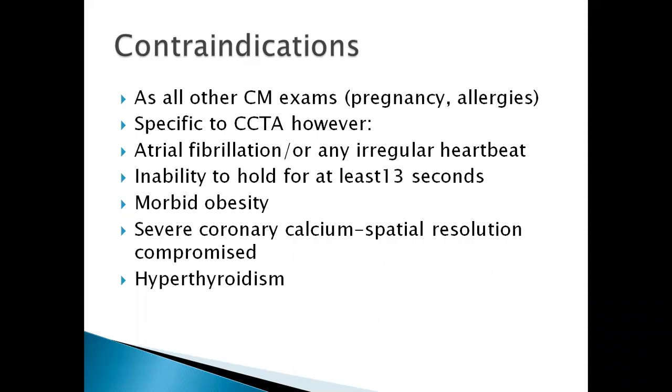So reduction of motion is one of the big factors that you have to think about at the back of your mind. Whatever you are doing, just think at the back of your mind, how can I make sure that the motion is as low as possible without harming the patient? So conditions like atrial fibrillation also become a contraindication because it directly affects the temporal resolution.